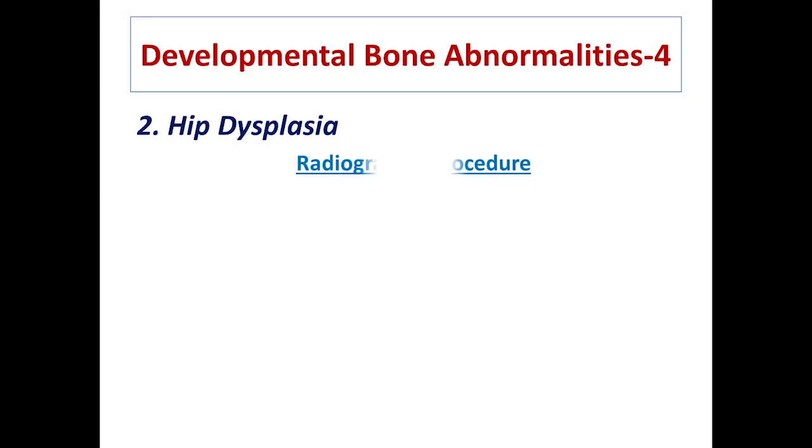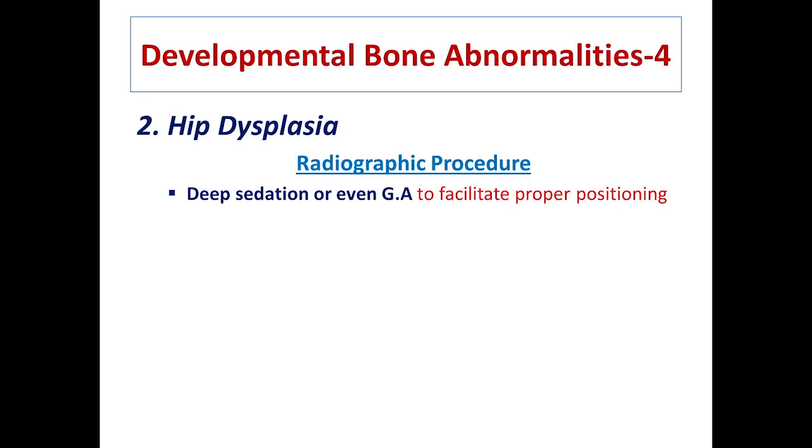Come towards the radiographic procedure. Always remember to attain proper position. You have to sedate the dog. Without deep sedation, it's not possible to attain proper position.